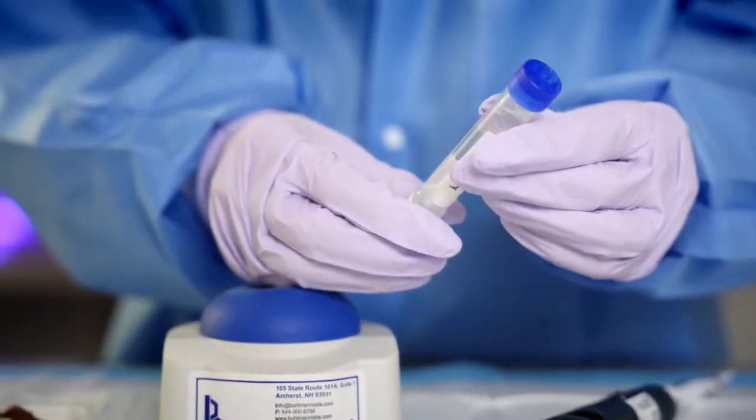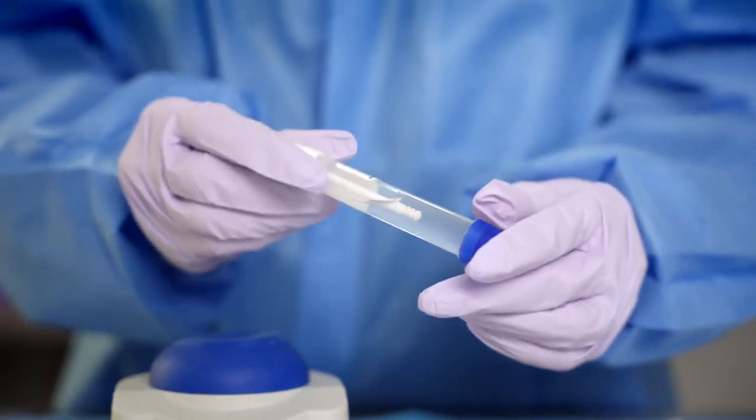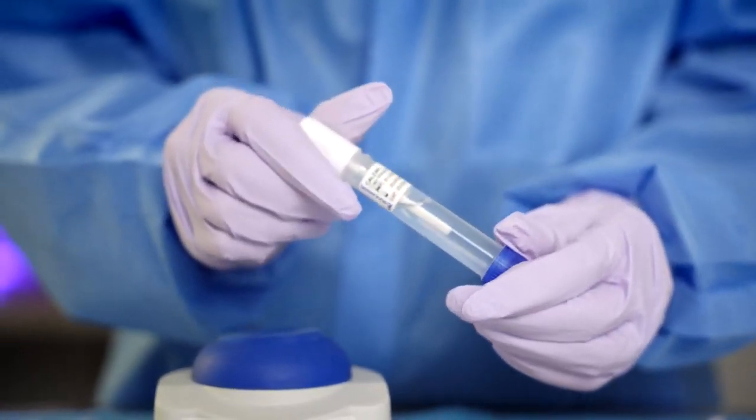The blue screw-on cap should not be removed prior to measurement. There is one exception for this and we will discuss this later. The easiest way to get the dosing tip out of the Calix CAP body is to hold the Calix CAP upright, twist and pull.